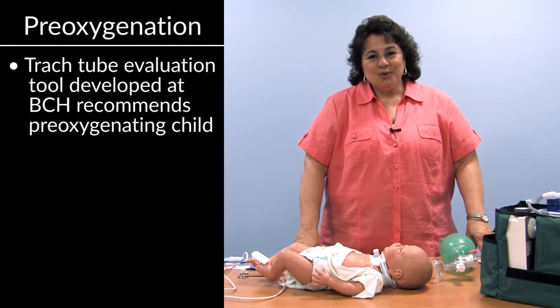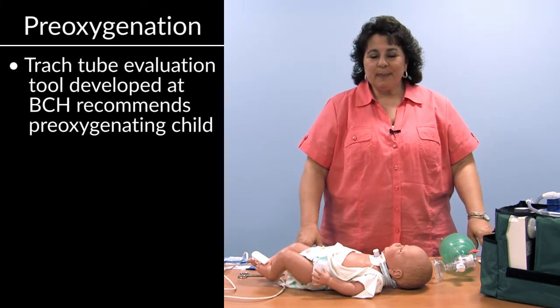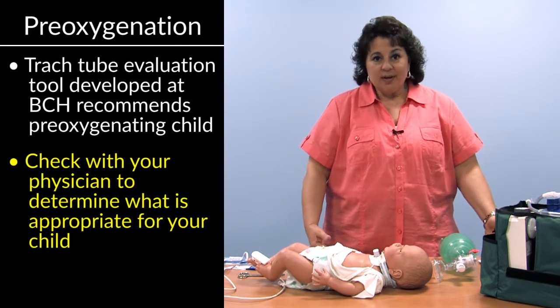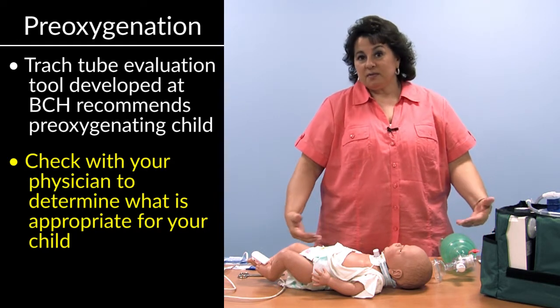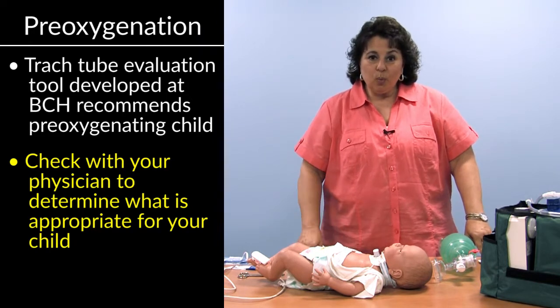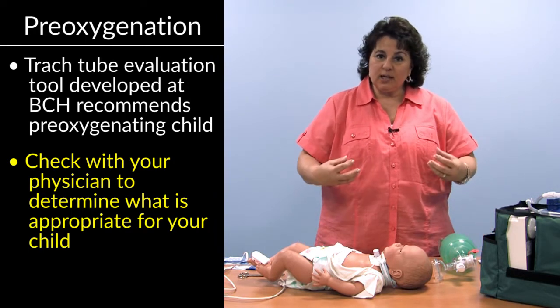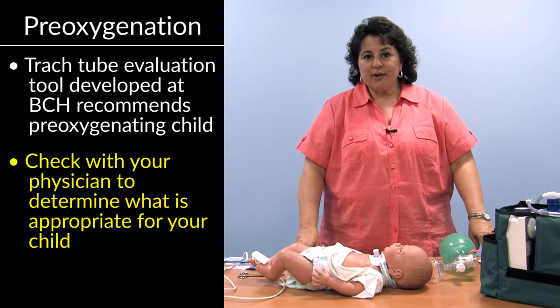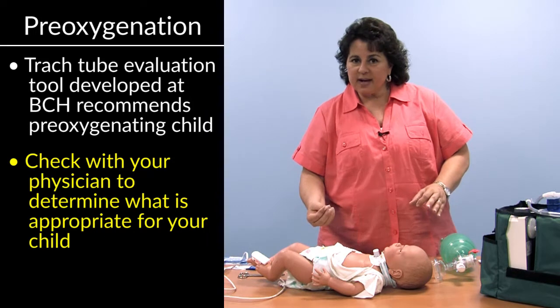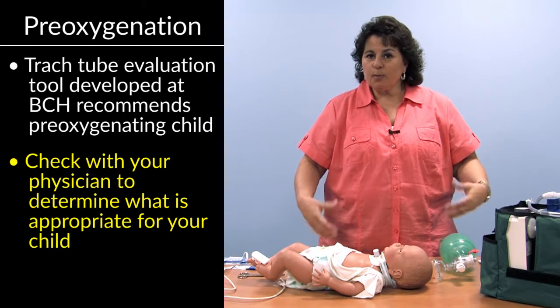In the tracheostomy tube evaluation tool that we're using today, developed here at Boston Children's Hospital, we do recommend pre-oxygenating the child with oxygen. You would need to check with your physician to find out if that's appropriate and not contraindicated for your child given their diagnosis and disability. So we will add oxygen to either the ventilator circuit, the trach mist collar, or perhaps the heat moisture exchanger for a couple of minutes prior to changing the tracheostomy tube, just to give us a little bit of time if, when it comes out, it's more difficult to put the tube back in. It'll keep the child's body saturated just a moment longer.